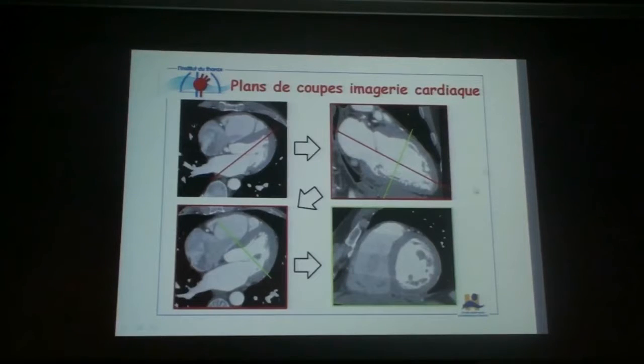From this plane, you're going to position another one that goes again from the center of the mitral valve to the apex of the left ventricle, so that you get a four-cavity orientation, and this four-cavity is going to make you recognize the right atrium, the tricuspid valve, here the right coronary artery, the right ventricle, and then the left ventricle, left atrium, and the mitral valve.